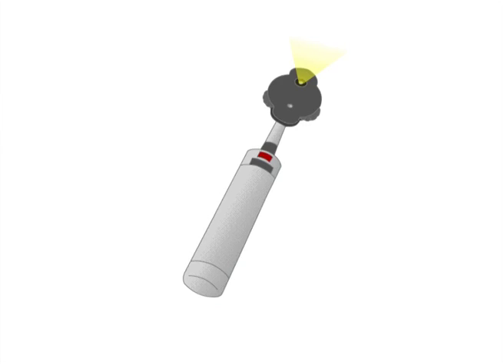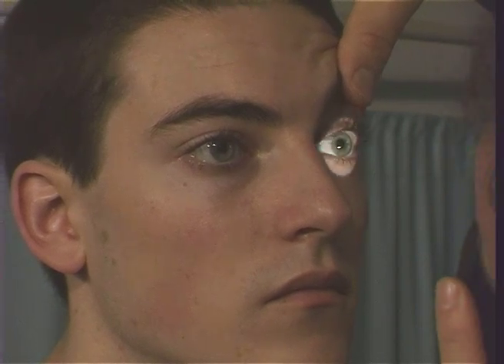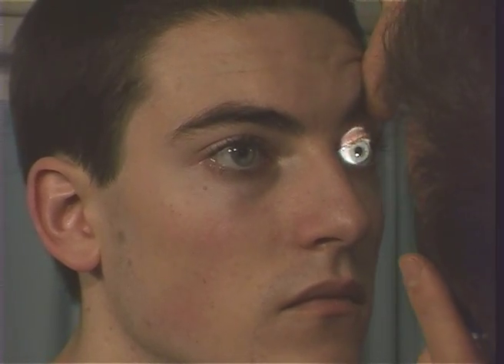A slit-like beam is sometimes used to assess elevations or concavities on the retina. The strength of the beam can be adjusted with a rheostat control on the handle. When examining a normal or emmetropic eye, the image is magnified 15 times. This occurs because the cornea and the lens of the eye themselves act as magnifiers. The choice of lens you will need to establish a clear image will depend on your distance from the patient as well as any focusing errors from your eyes and the patient's eyes.